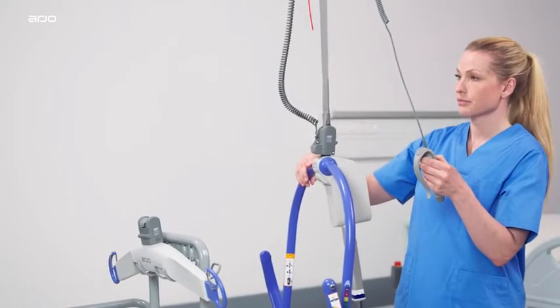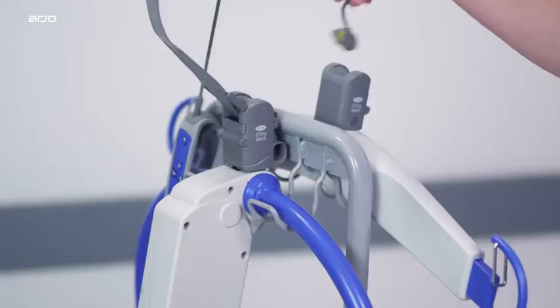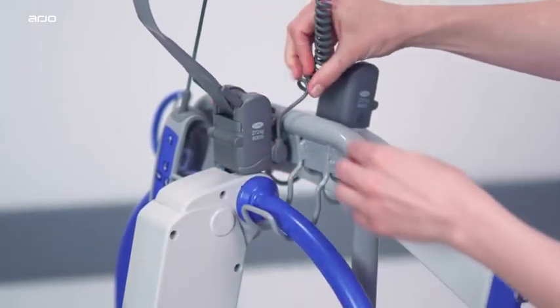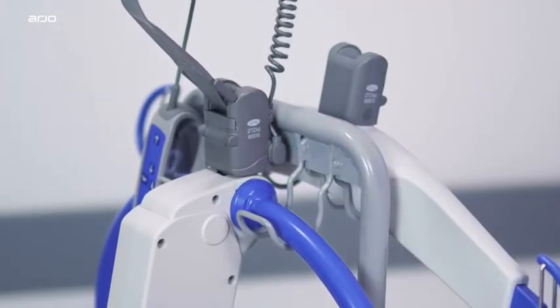If using a PDPS, secure the base of the cable to the housing of the Maxi Sky 2 and connect the cable plug. The cable is connected between the lift and the spreader bar. There's no connection for the cable on the scale.